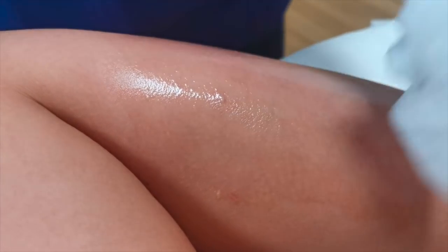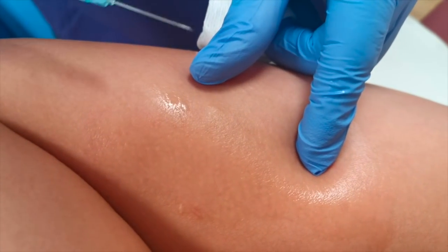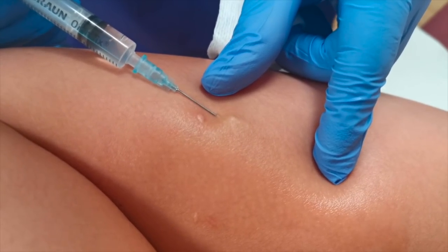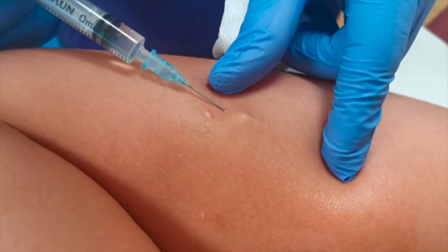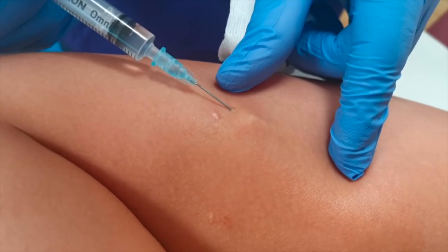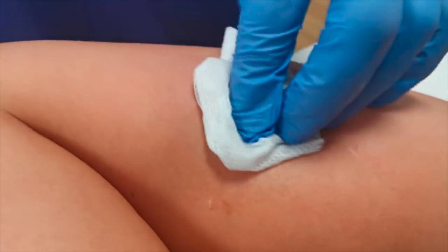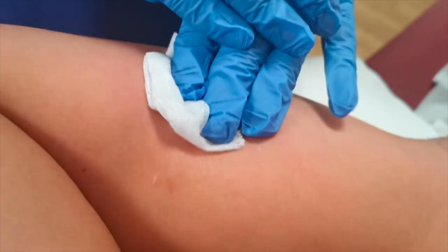This feels like a bee bite, but unlike a bee, it does disappear and it goes just underneath that as well. Sharp scratch, doing really well. There we go. This is the anaesthetic going in. We'll just put it in slowly. There we go. Well done. Keep breathing. That's it. Once the anaesthetic's in, you won't feel a thing. Doing really well. Okay. Let's put that all in. Let's just massage that through. There you go. Well done.